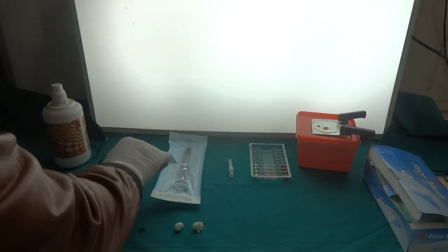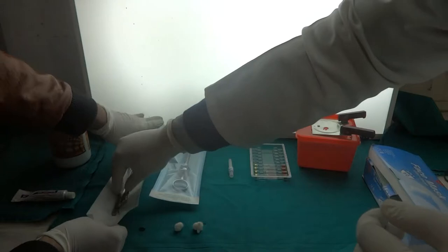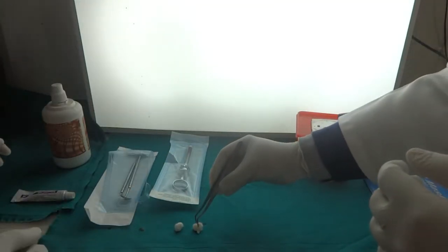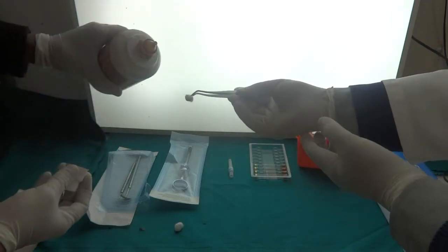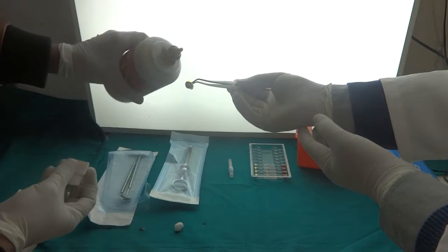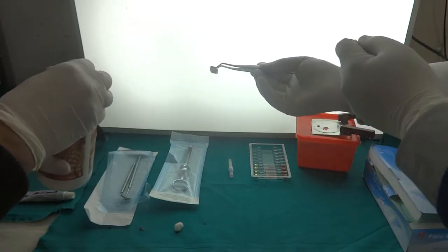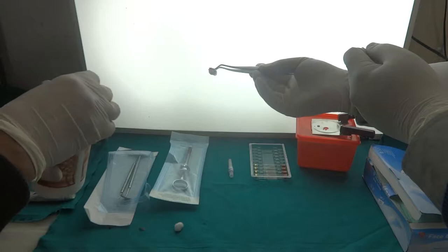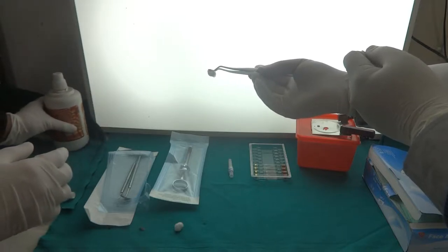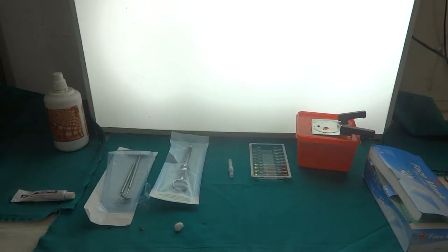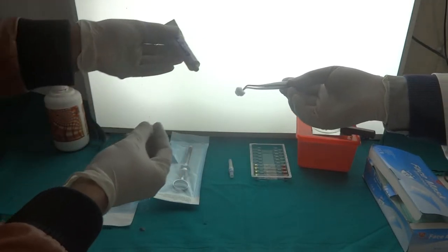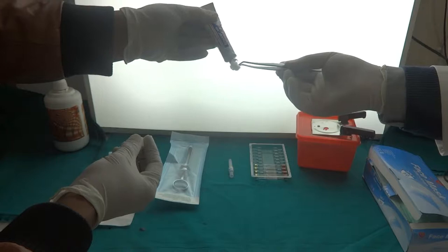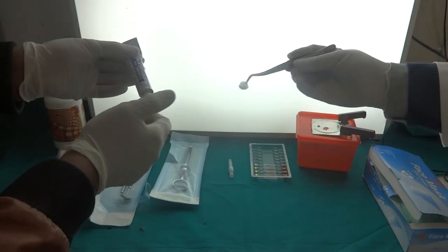First of all we will wear gloves and then we will apply antiseptic solution on the cotton palette and place it in the buccal vestibule. With the help of another cotton ball we will apply topical local anesthetic solution and place it in the buccal vestibule.